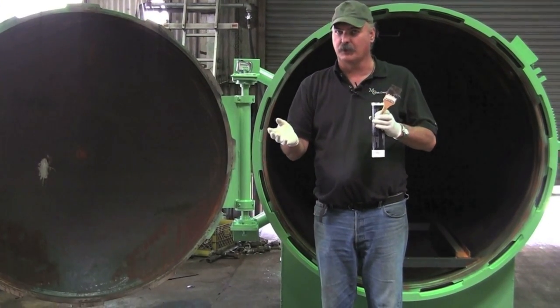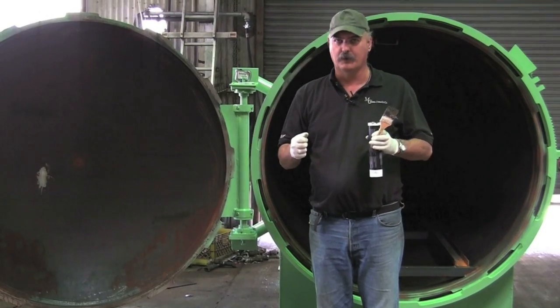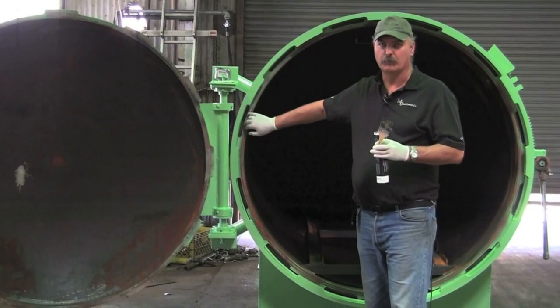And number two, sometimes when they get hot, you go to open it and it'll be stuck to that door and it'll pull right out of the groove. The seal right here will pull right out of the groove when you open the door.